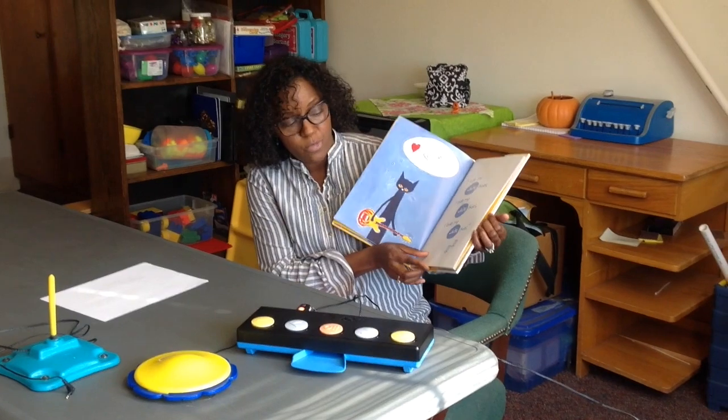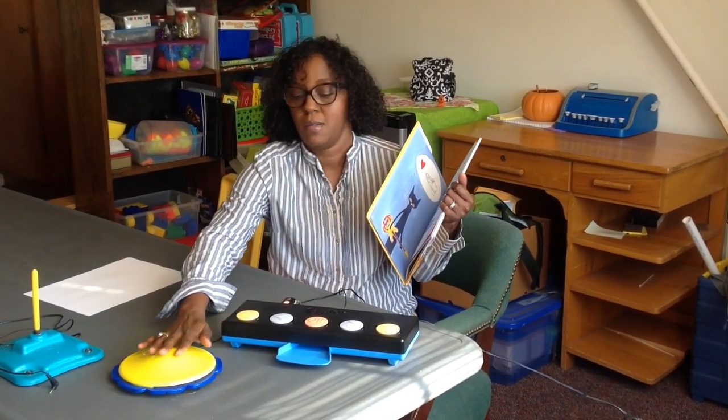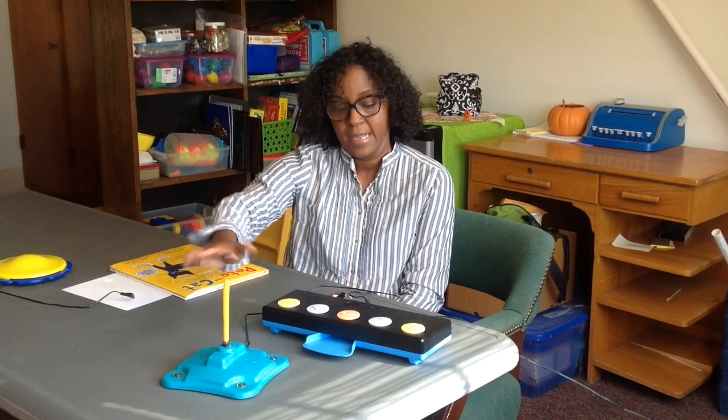And so they're presented with the visual as well as the audio. And for some of our kids that have even more limited range, then the stick switch works better for them because all they need to have is that swiping motion and they can activate the story.